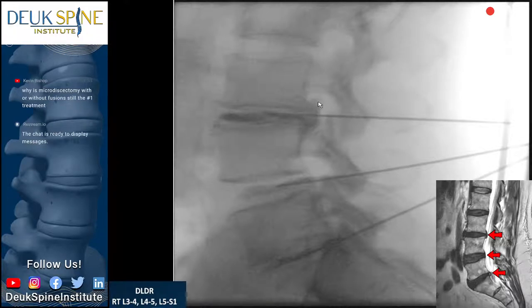Right back, a little further to the right, there. That white area there is where the nerve root. Little to the left, right where the arrow, little to the left, right there. That's where the nerve root's coming out. So you can see the herniation is gonna be bulging out against the nerve root and also causing inflammation on the nerve root. Flynn, go ahead and show the video while we get started as to why herniated discs cause back pain and leg symptoms.